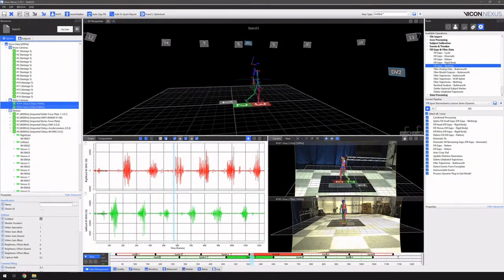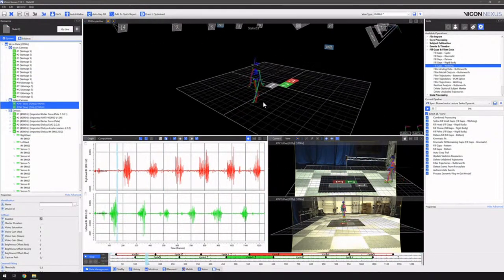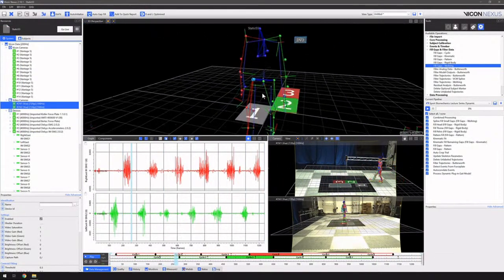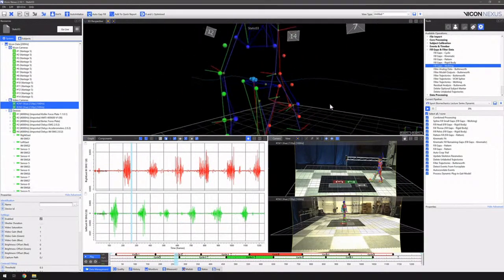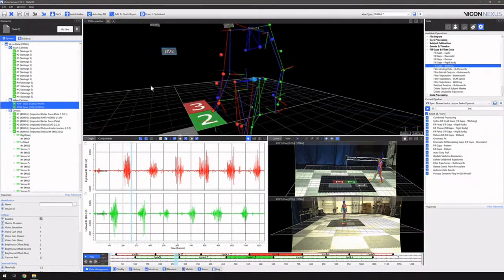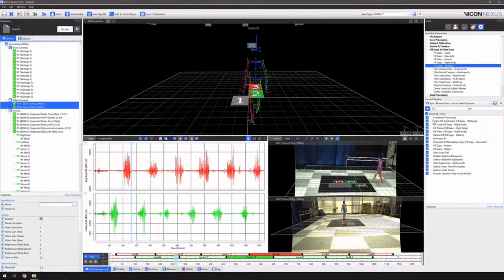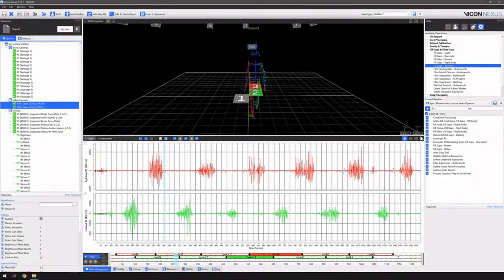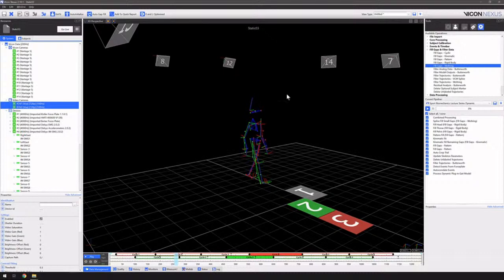Including the video overlay. Now that we have the hip joint centres calculated using the Plug-in Gait model, we can also calculate them using a functional method. So now I'm going to go back live, where we will record Emily doing a functional motion in order to calculate the hip joint centres and the knee axis of rotation using the SCoRE and SARA method.